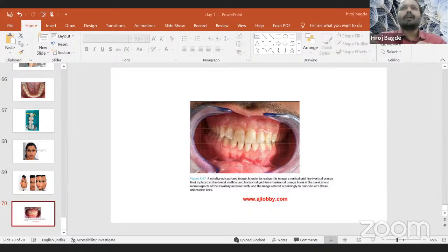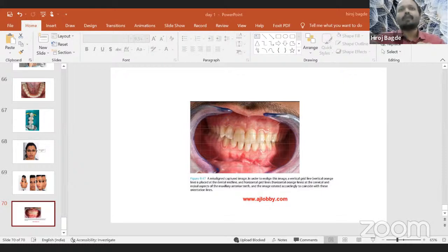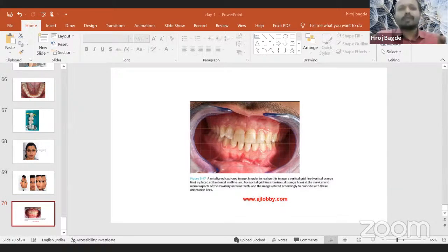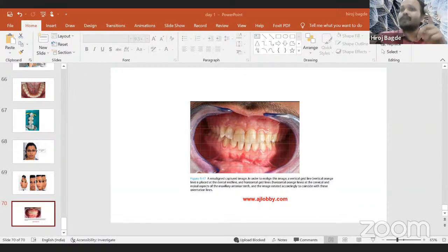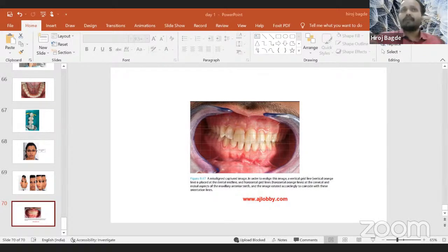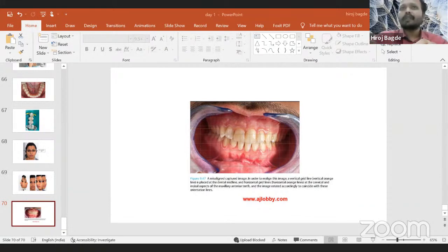We can also adjust the temperature of the image — this is what we called 5600 Kelvin. We are going nearby to it. I want something not yellow, not cyan. I will go in between so that my histogram shows some changes. Now this is not beautification — this is what is called image processing. This is a free software and can easily be done for every image. We don't have to over-process the image. We should have a neutral color picker and histogram tuning. Even if you want shade matching for composites, you can use the black and white filter.